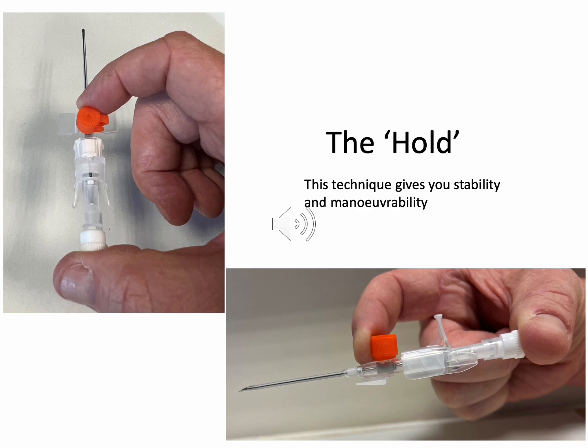It may feel initially like there is no stability or you're about to drop the cannula, but I assure you that with enough practice, this will cease to be the case and you will see that it is quite stable and maneuverable.